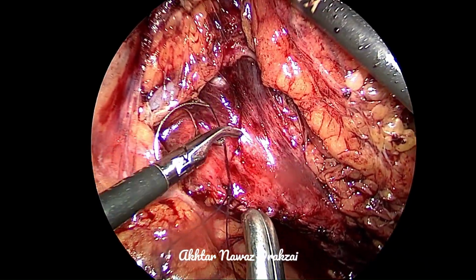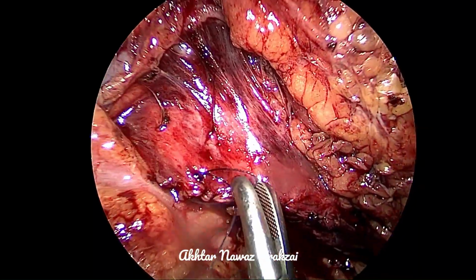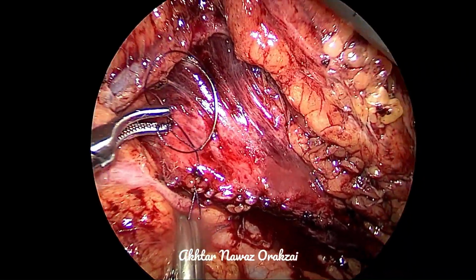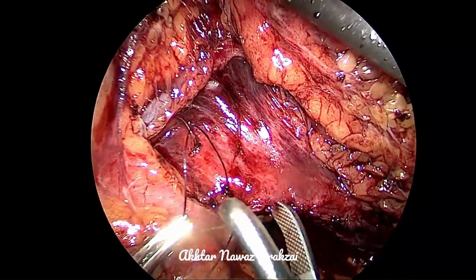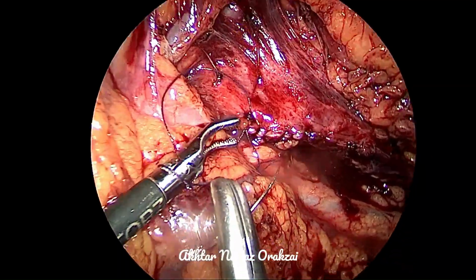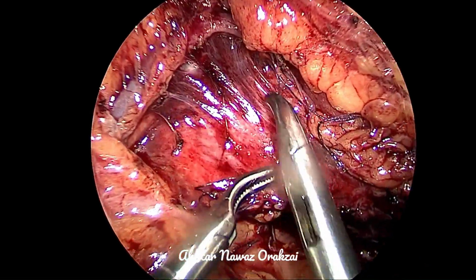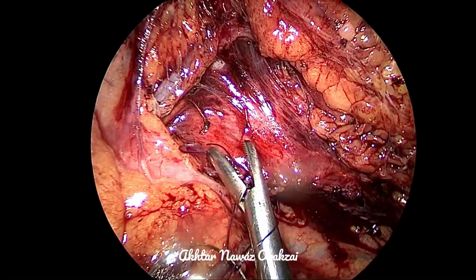Then we'll place a drain, and after that, we will remove the stones through one of the port sites. I hope the stones are not very large in size, and can be removed easily through the port site, a 10 millimeter port site.